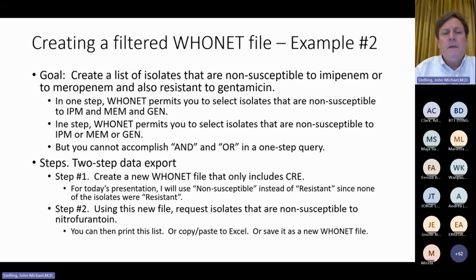So that was example number 1. Example number 2, create a list of isolates that are non-susceptible to imipenem or meropenem, but resistant to gentamicin.